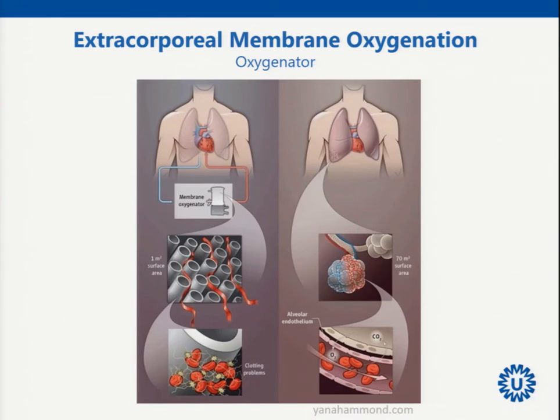So what happens here is that through these tubes, the gas mixture is flowing, and it's surrounded by the blood. So there, the gas exchange takes place. And there is, in fact, no possibility that fluid enters the gas tubes. That was a problem in older setups, but in the modern generation, this is really divided strictly. So in there you can see how the gas exchange happens. It's actually pretty much the same as in the native alveolus.